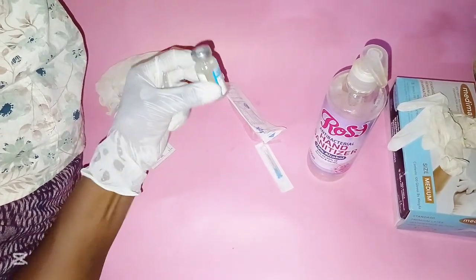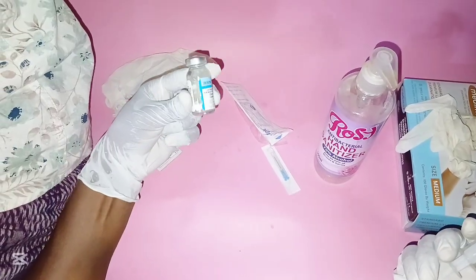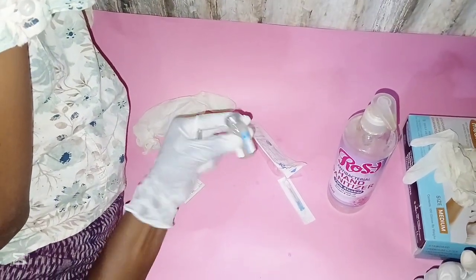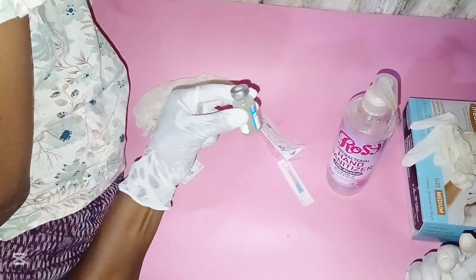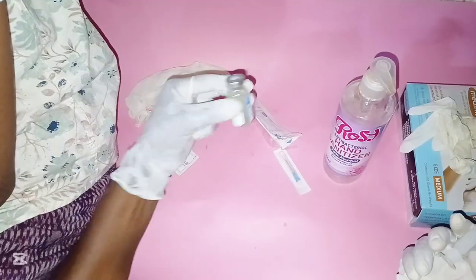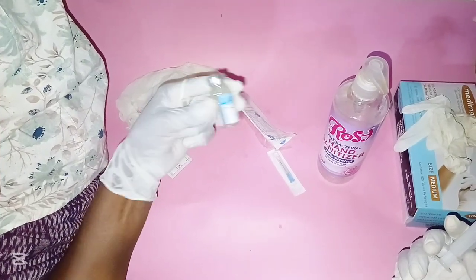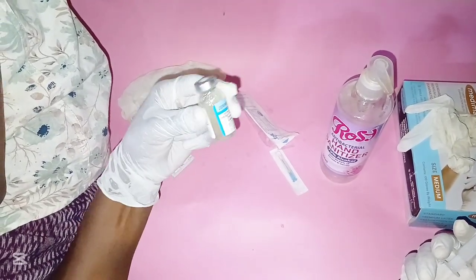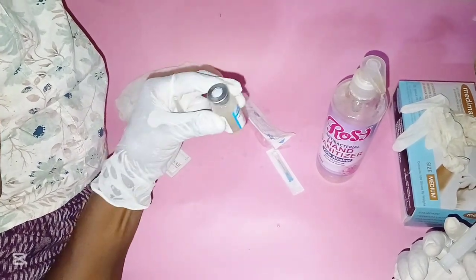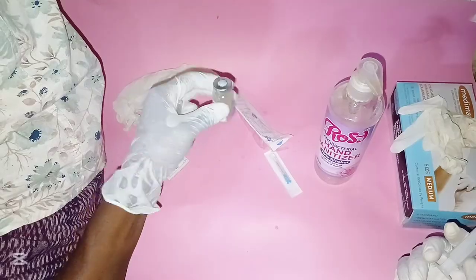Shake the vial gently to allow the drug to dissolve slowly. Continue shaking the vial for a while until the drug is completely dissolved.